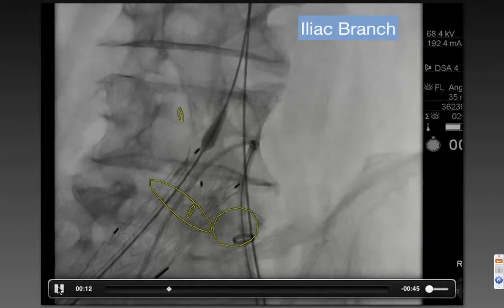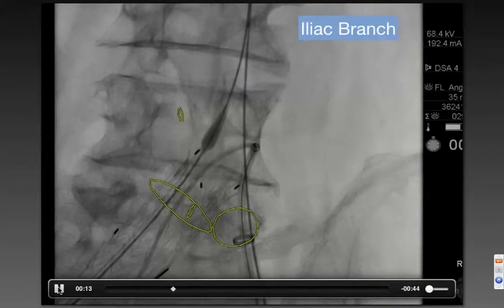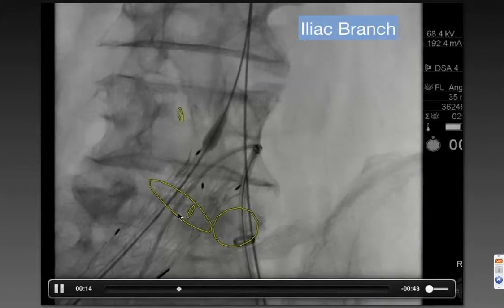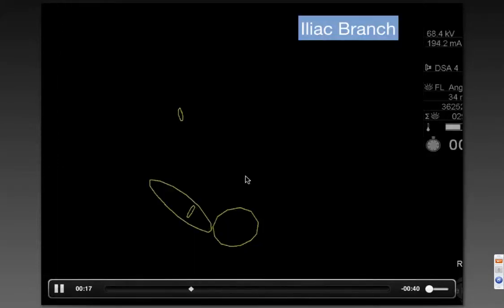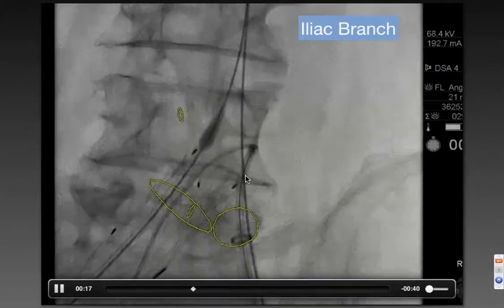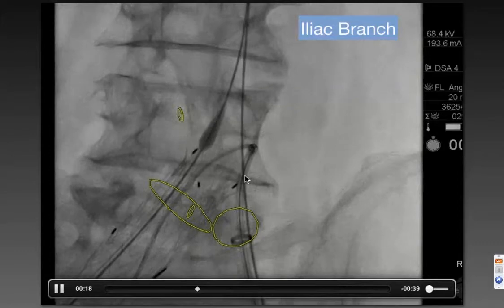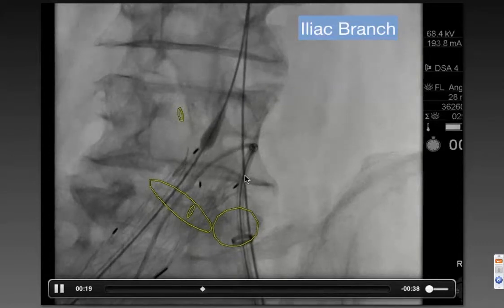So what we do is retract the entire system, take some of this curvature out of the sheath at the same time, and let the whole thing sit back on top of that bifurcation.